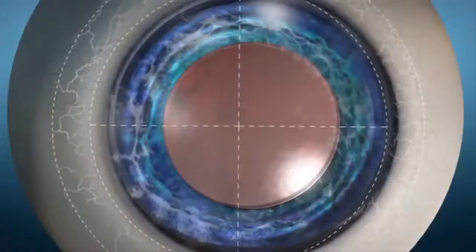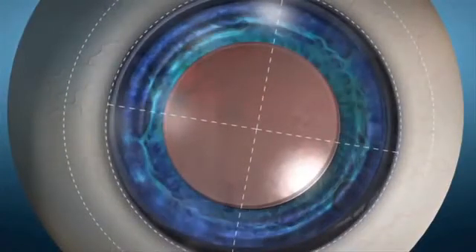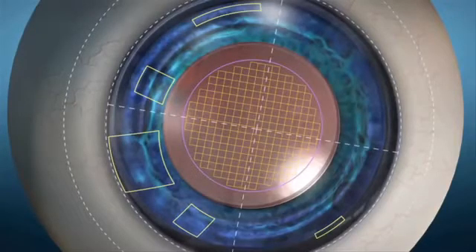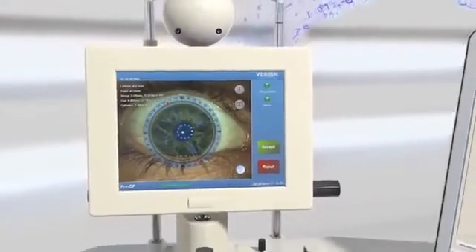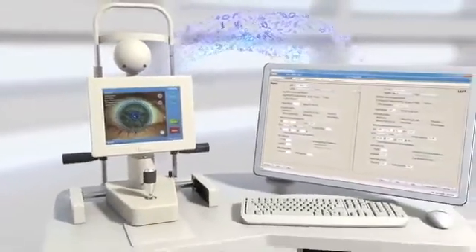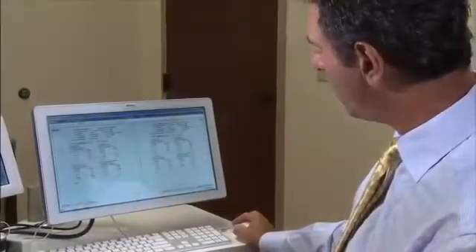This fingerprint of the eye is used to register and track the eye as a visual reference of all incisions, capsulotomy, and IOL positioning. With the Verion Reference Unit, surgeons can also simply and confidently develop their surgical plan. Measurement data is automatically imported into the planning software, streamlining pre-population of data fields to optimize planning efficiency and minimize transcription errors.